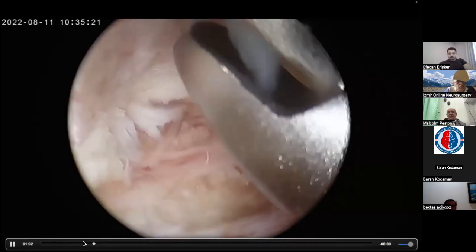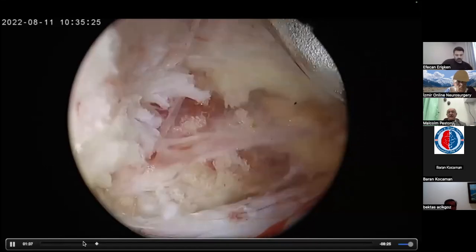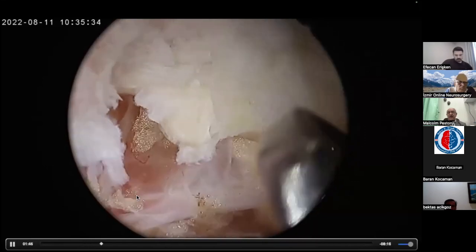This is cutting of the superior articular process, the foraminal ligaments, the flavum that is there. The facetal capsule is white. And you can see how nicely I'm freeing up the entire nerve root. So you can expose the entire exiting nerve root.